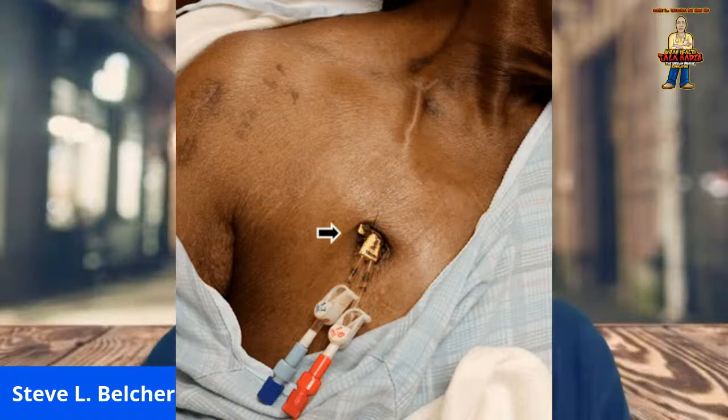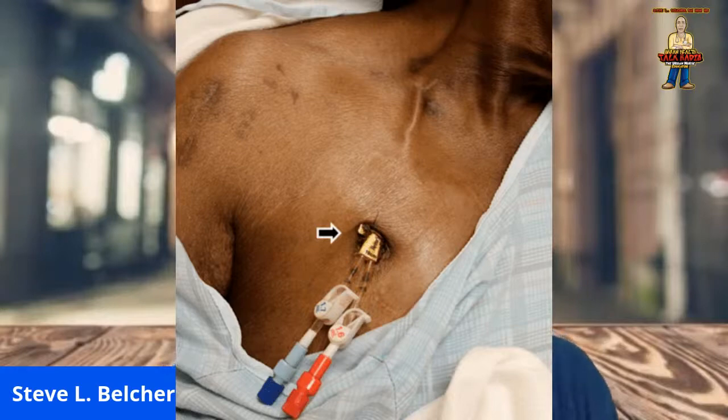Here are the signs and symptoms of a catheter infection, as I mentioned before. Fever, chills, drainage from the catheter access site, redness or tenderness around the catheter access site. Now, where that arrow is pointing, that is the catheter exit site. And general feeling of weakness and illness.